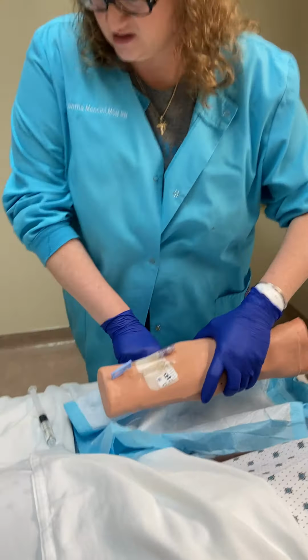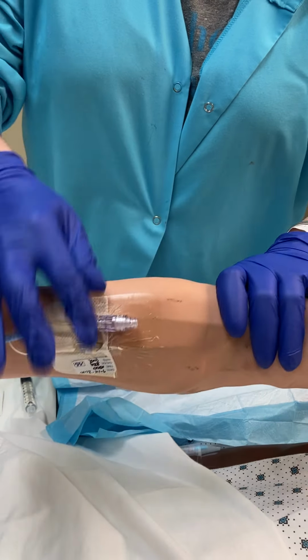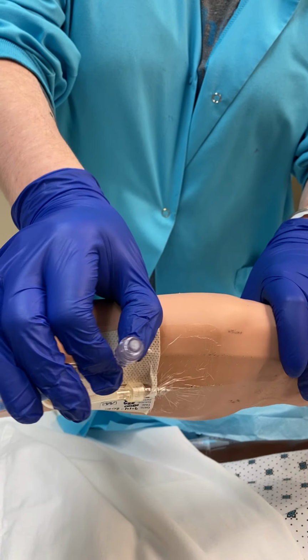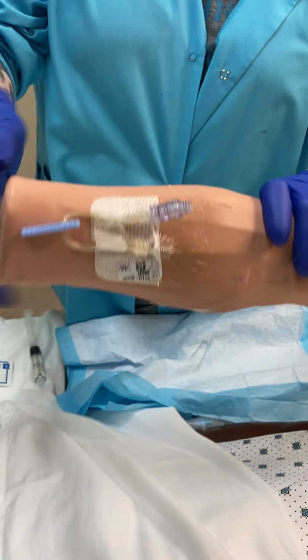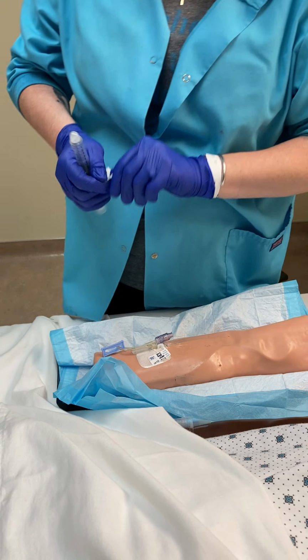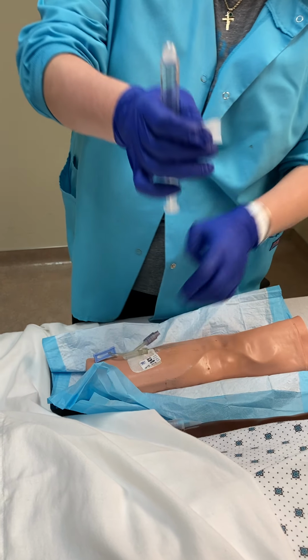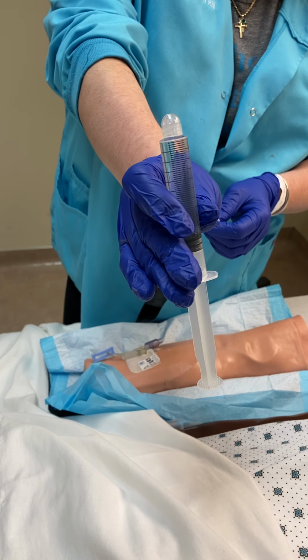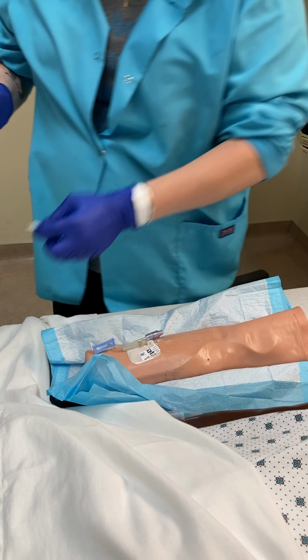If you look closely, there are two different kinds of connectors that you'll see. More than likely you're going to see this one, and this is a luer lock connector. This is a complex connector, and it's also a positive pressure one. For this one, we don't need any special attachment to our syringe when we flush.